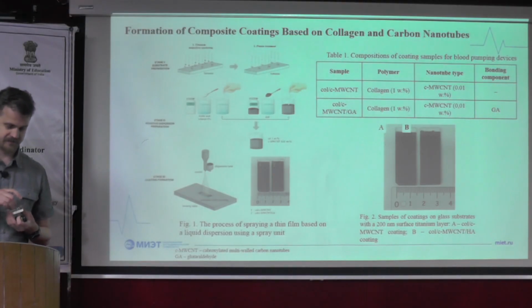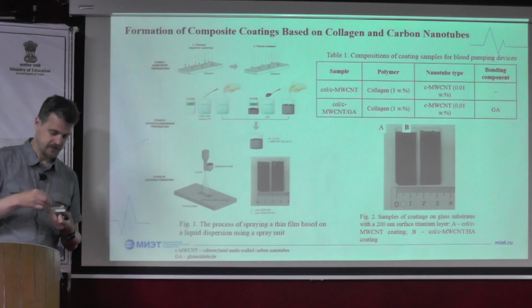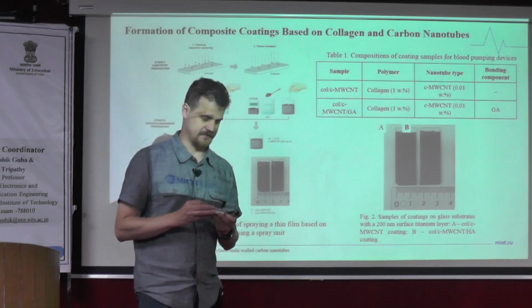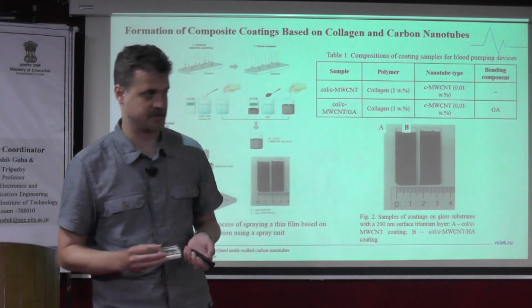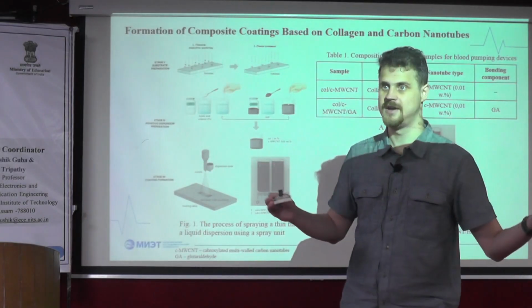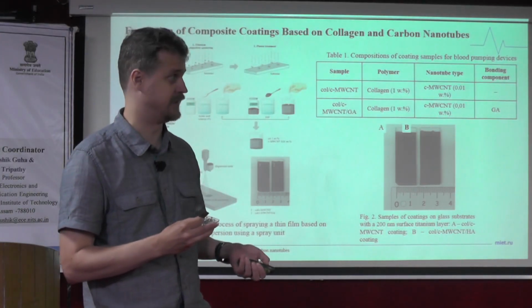It was manufactured by our colleagues, specifically by a very prominent scientist and engineer, Kristina Popovic. She is working on the issue of blood clotting in the artificial heart system, but considering that in terms of the interaction with blood, the implantable artificial kidney and artificial heart are very close types of apparatuses that experience basically the same issue that has to be addressed.